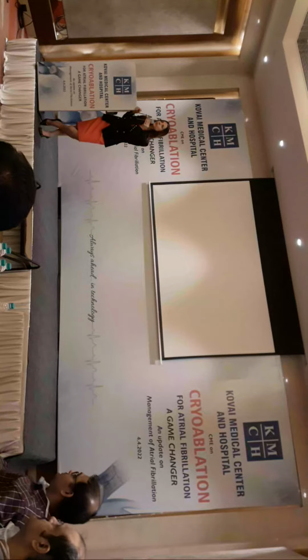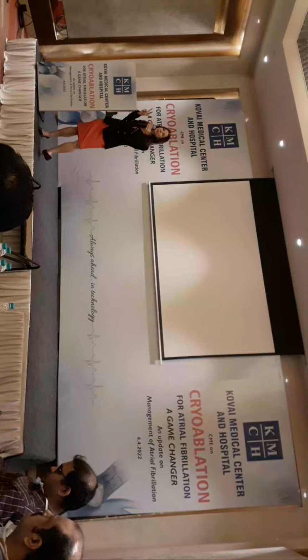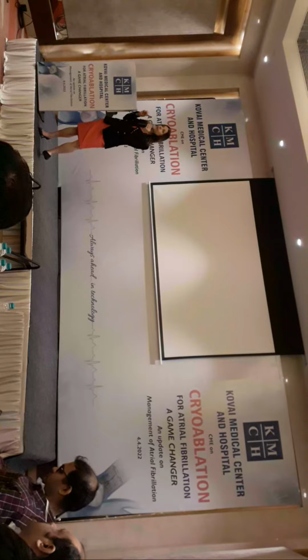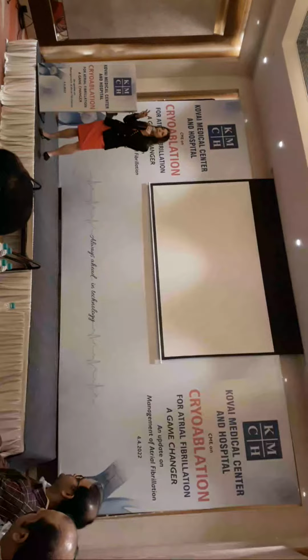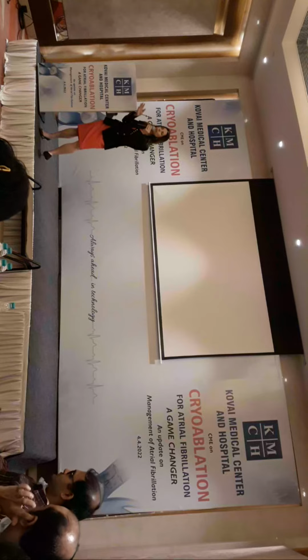No, so first, how many ablations will I do? 2. Rarely there's been a third. Now, the exception is if ablation's been done elsewhere and people have left atrial flutter, or if I go in and find that the veins were never isolated. It's amazing, especially in the early days of AFib ablation with the cryo balloon. The first generation balloon only had 4 ports. If you didn't do a really extensive job, those veins reconnected.